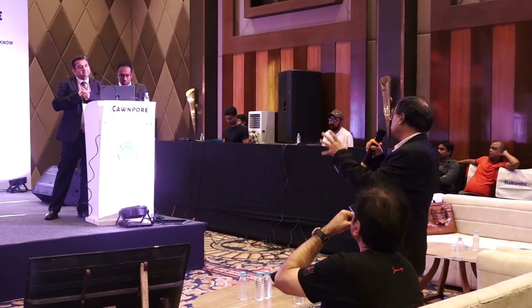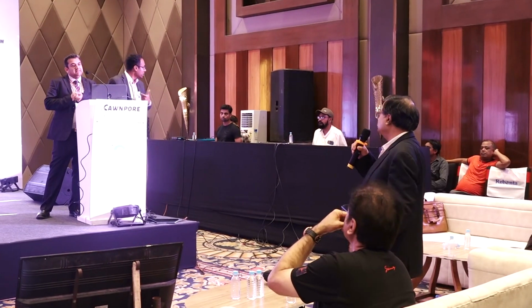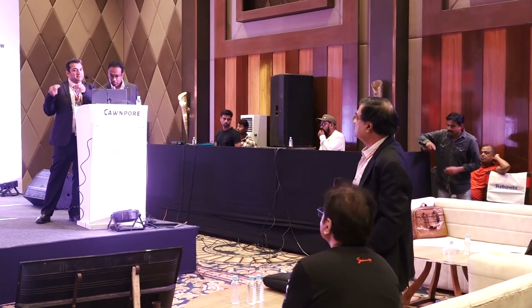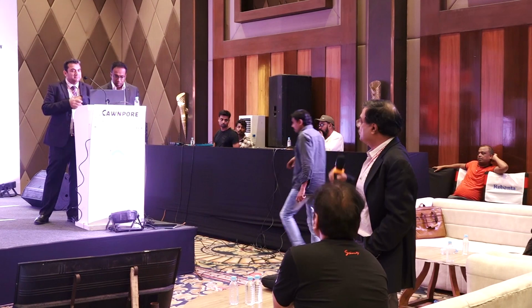Do you send histopathology? One worry is infection, because these implants have been lying for so many years. Do you look for neutrophils intraoperatively? Yeah, you saw that tissue I was removing, that has gone for biopsy as well as tissue cultures, and the head also. So, frozen section?